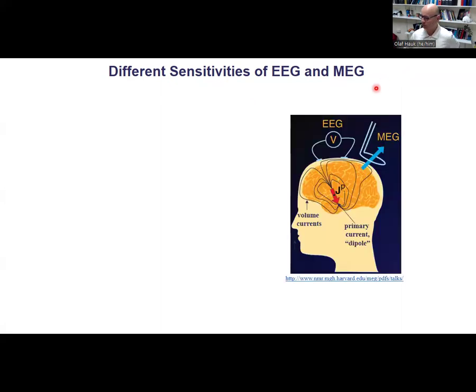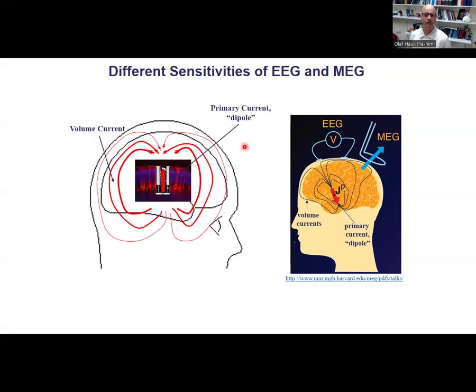So in order to look at that, I'll just put a few slides together here. Some of them I showed before. Let's just remind ourselves that EEG and MEG do measure effects of the same sources, so these primary currents here, but they measure different aspects of them. So primary sources produce these volume currents, and they produce electric voltage differences on the scalp. Both primary and volume currents produce magnetic fields. We measure them with MEG. So this already suggests that we measure different types of information, which might be useful for different purposes, but maybe together, you will actually get the most information out of it.